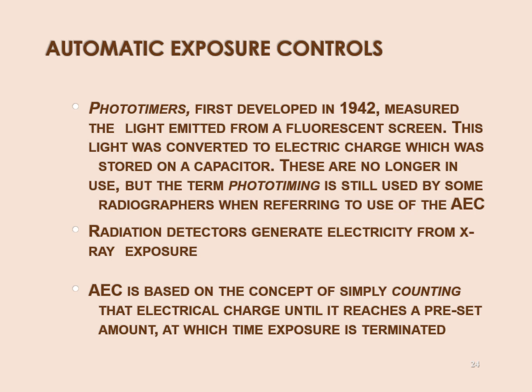When the capacitor reaches its threshold charge, it discharges, drops all of that charge into an electromagnet that activates and opens the switch on the exposure circuit. Okay?